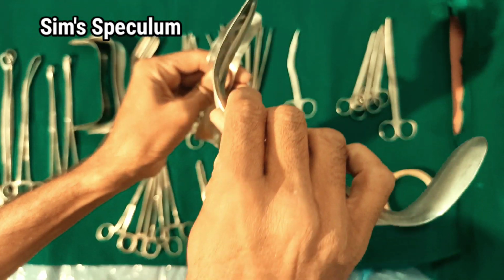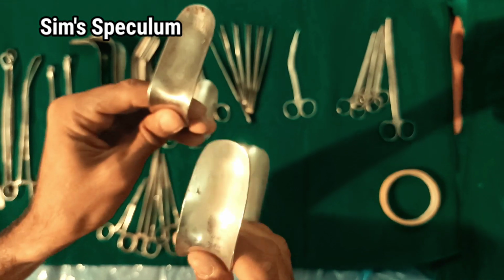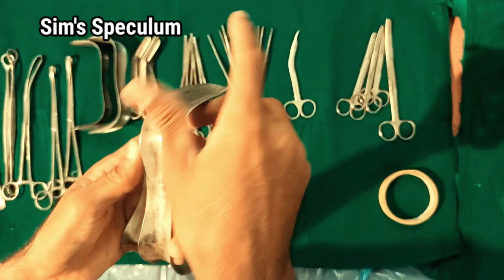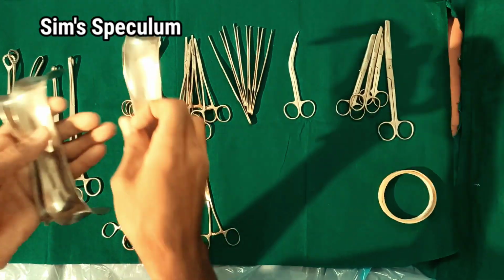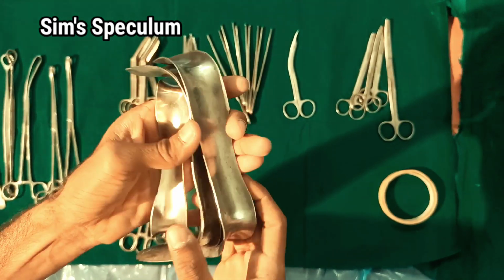The groove in the middle of Sims speculum allows free flow of secretions and blood to the outside, thereby keeping the area dry. Sims speculum is available in various sizes, and the size appropriate to the vaginal dimension of the woman is chosen for use.